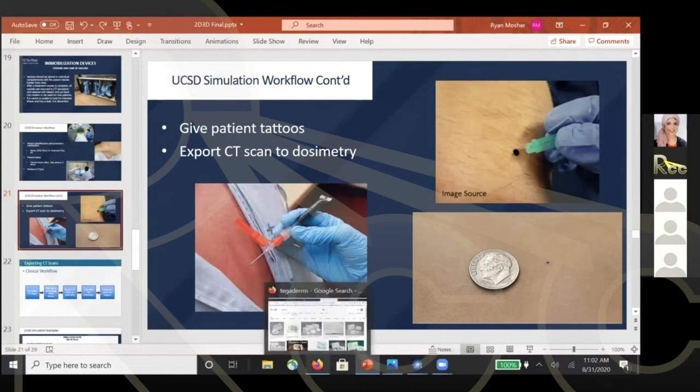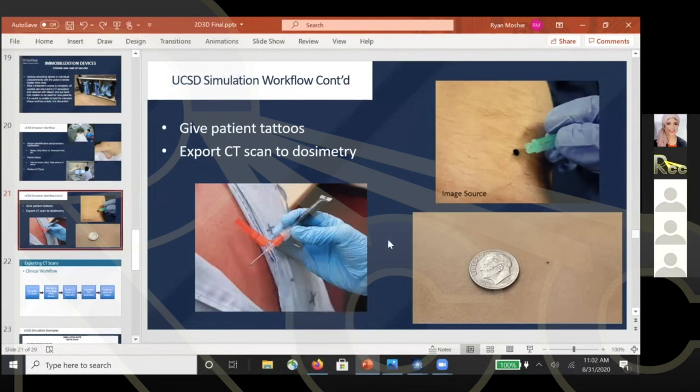I don't tattoo the new ISO. I just mark and ask the therapist to keep marking every day when he delivers the session, just confirm the mark every day. And put a plaster or something in case he has a shower or something like that. I don't do another tattoo for the real ISO. That's the same thing we do.